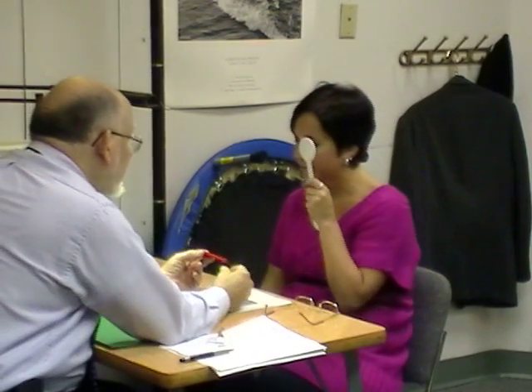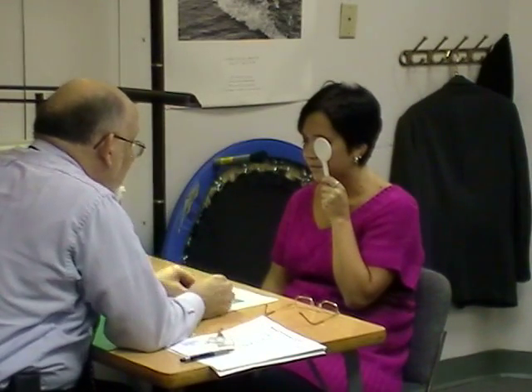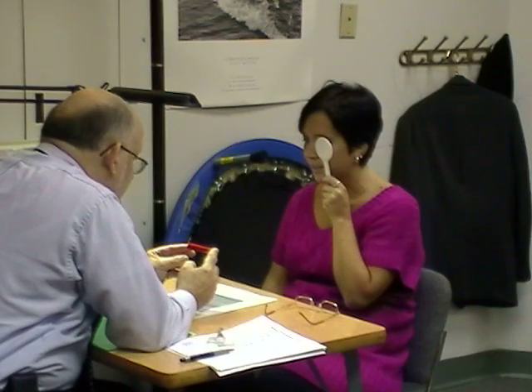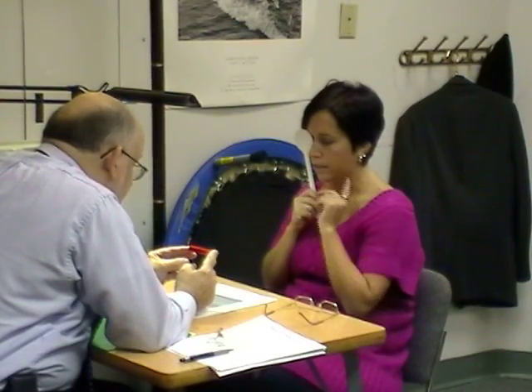Let's do one other thing on camera here. We're going to use a little red cap as a basis of red. I want you to cover your left eye and get an estimate to yourself of how red that is. Okay, and switch. Is it the same color red? Is there a quality difference? Well, it seems like it's a little bit brighter with the right eye. So using your left eye it's brighter? No, the opposite — the right eye is brighter. How about if we take, when we increase that prism... it looks the same color, just one is brighter than the other. How much difference? Is there a 10% difference? A 50% difference? Like 10%. That's about a one point difference.